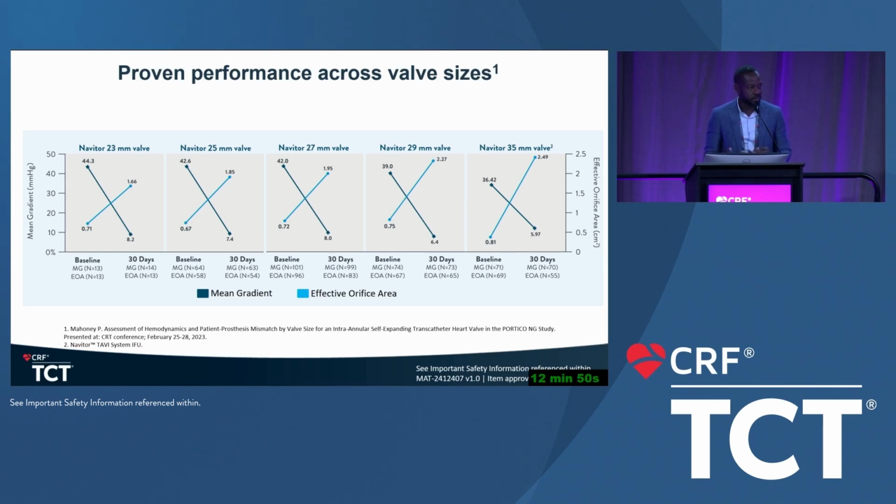You see that slide with extremely nice and acceptable EOAs and gradients, whether in the small annular range or the large annular range.